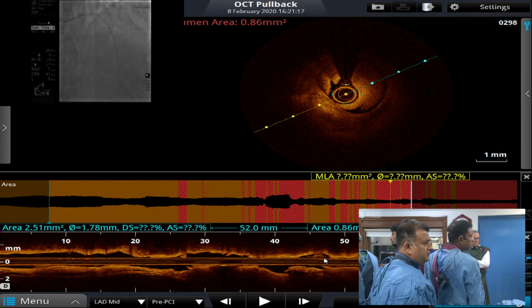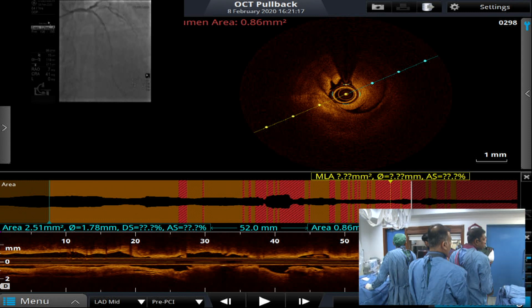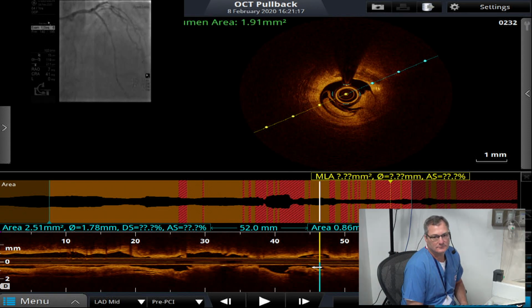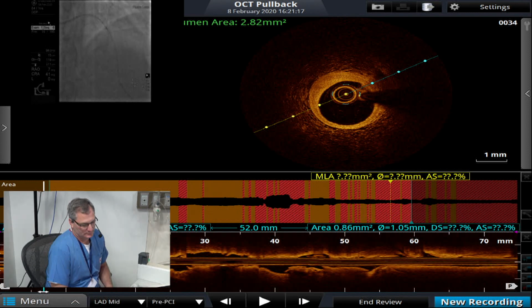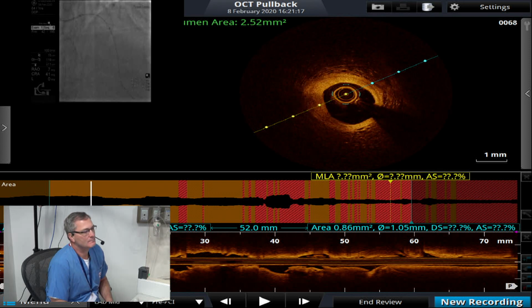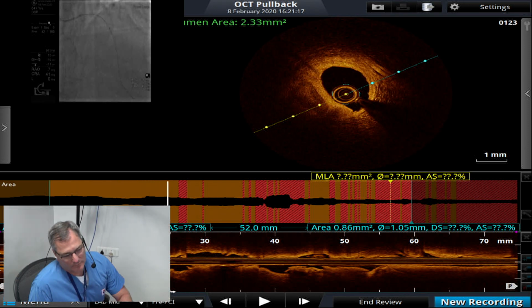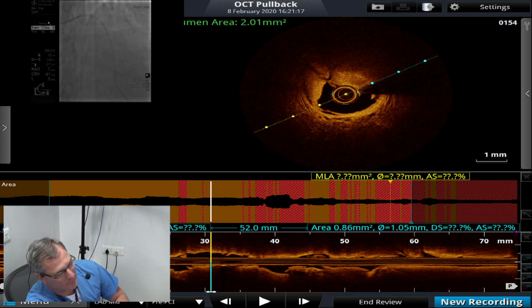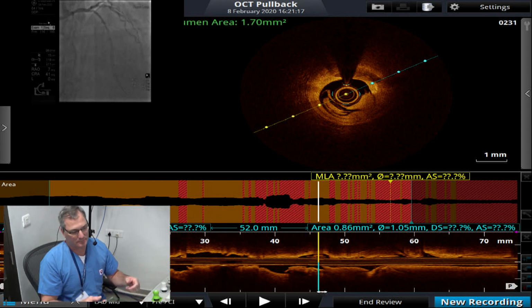Aaron, can you explain? You were saying that we'll do the OCT, and if there was severe calcification requiring atherectomy, this is how you would do the case at home. So what would be the next step, if the OCT showed severe calcium and you wanted to do atherectomy? Can you walk us through? We would go to the robot. We would push on the screen the device exchange and follow the steps.